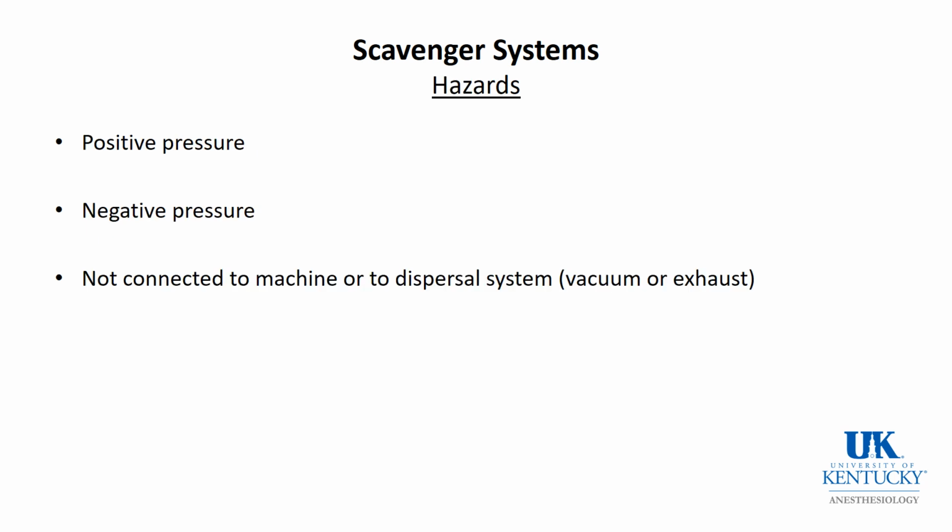There are problems with these scavenger systems. It's in your checklist to check that they're working. The positive pressure system may not be working properly, the pop-off may fail if the negative pressure is too high, or it may not be connected to the vacuum system in the hospital.